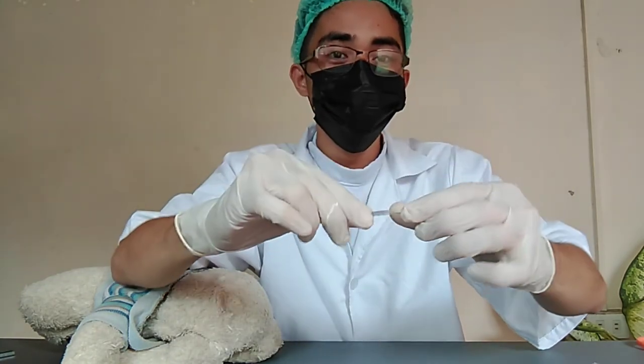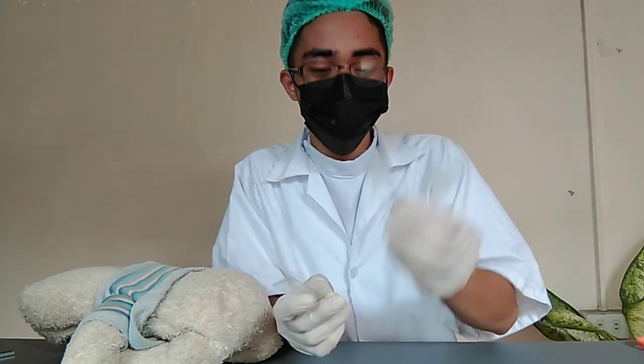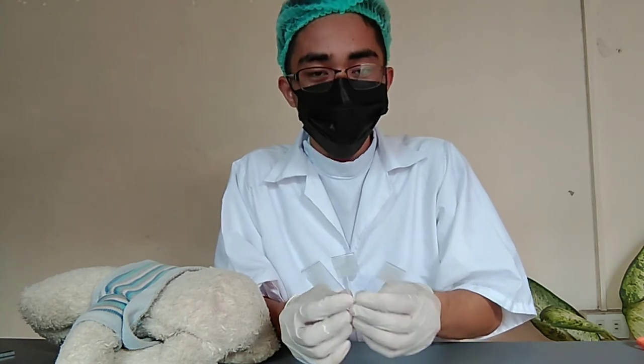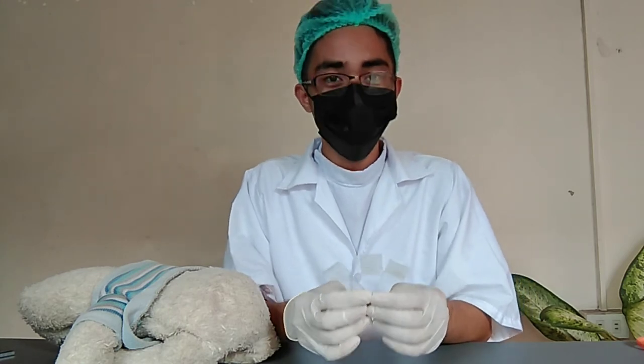The slide is now ready for the examination of the egg. Do the same procedure with the other slide, making sure that you have enough sample for an effective examination of Enterobius vermicularis.